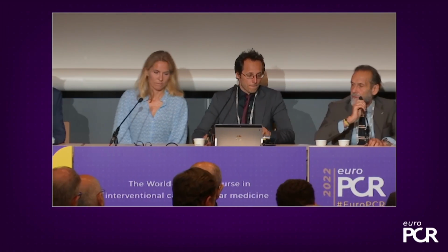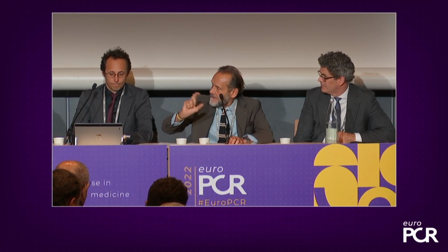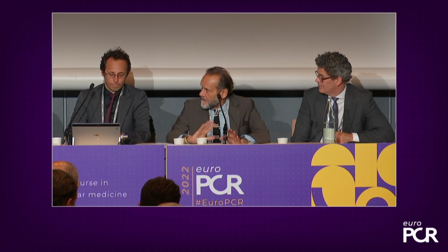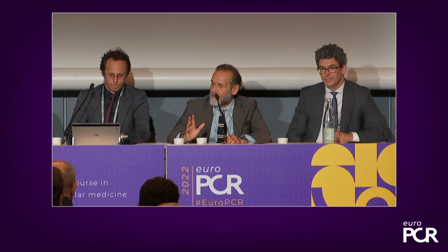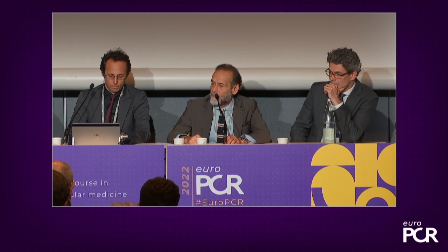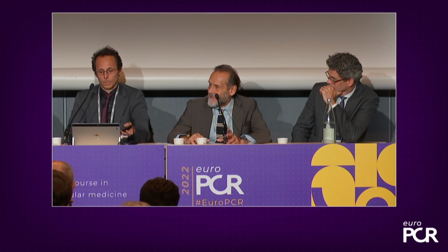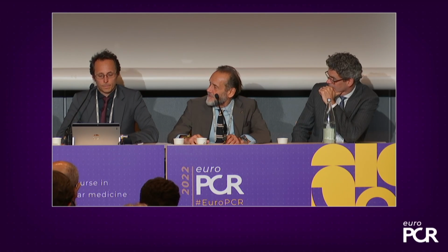Just one question. I'm used to using all the runs in femoral more than in coronary, in all segments of the iliac femoral axis. All the runs. This is a suggestion for the audience too: don't miss one run, because it's very important to use all the runs. And finally, after the shockwave, I'm used to using a usual balloon to make just a massage of the femoral iliac axis. What do you think about this?